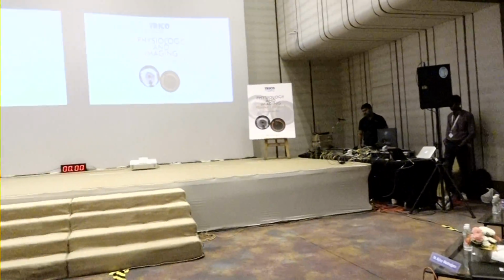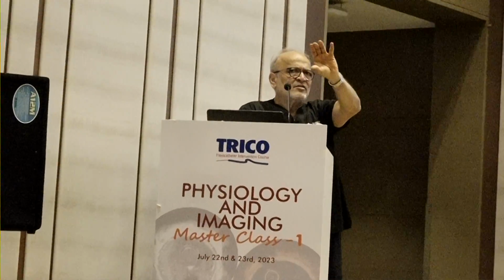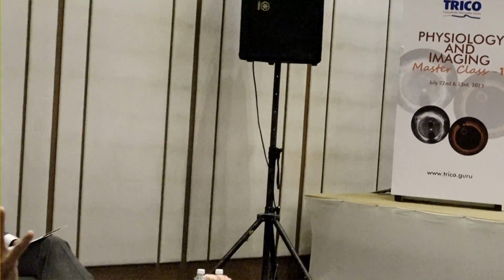For 1 year, yes, and then I think things settle, because many times we see arteries with endothelial dysfunction: tight stenosis, a relatively normal segment, a little bit of aneurysm, again tight stenosis. When we cover everything, we dilate that little bit of aneurysm, but we don't dilate to the extent that we break the stent struts. Right. As long as your proximal and distal result is great, the ectatic area eventually thromboses, and when we bring them back a few years later for a different reason, it's fine. It's always a smooth lumen there.